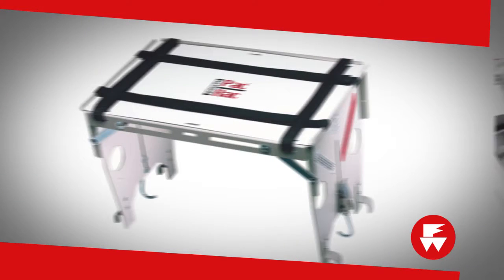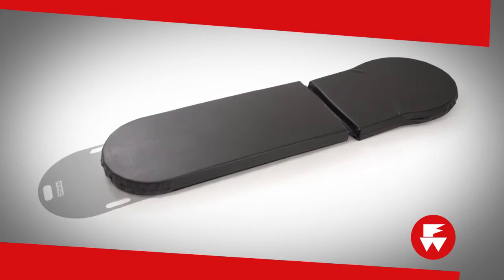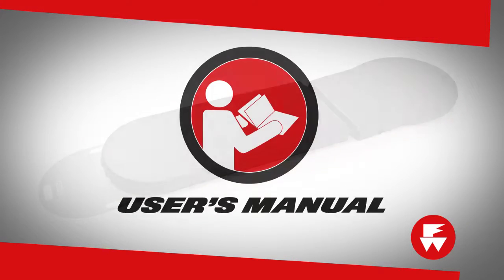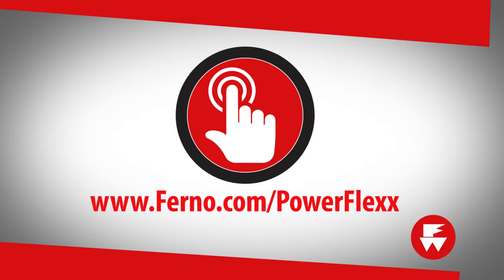The Pac Rac is ideal for holding an assortment of equipment. The transfer board is useful in safely moving patients onto the cot, and there's even a storage space for the board and an optional mattress. A complete list of accessories is available in the user's manual or at www.Ferno.com/PowerFlexx.